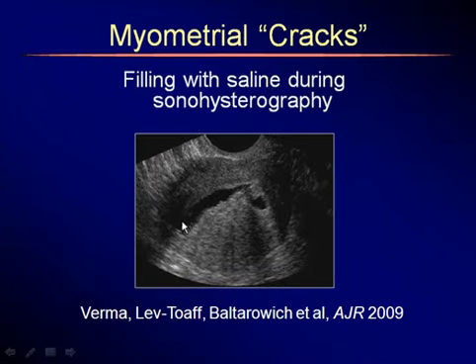Here's a sonohysterogram where we actually filled a small cavity. At the beginning of the examination, there was no cystic change here at all. And as we introduced some fluid, eventually this area filled out. So this is a filling of these so-called cracks in the myometrium, which were coined in an article that we had in 2009 showing that there are connections from the endometrium filling into these spaces.